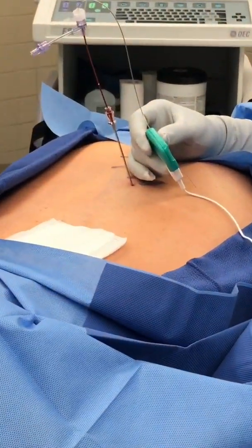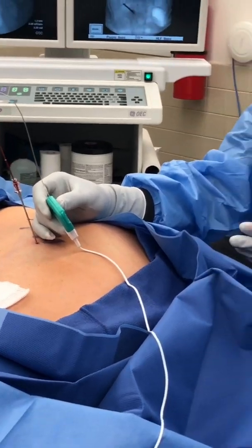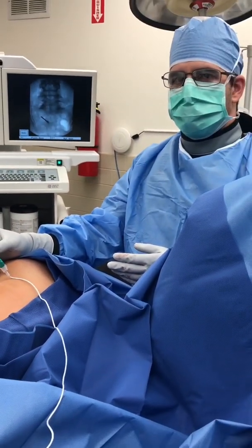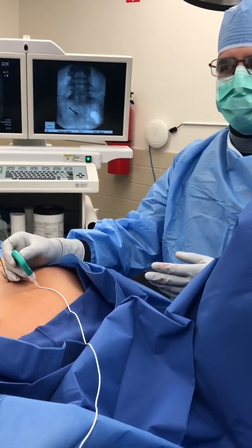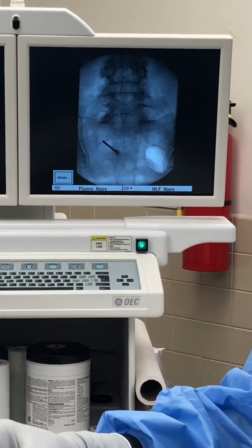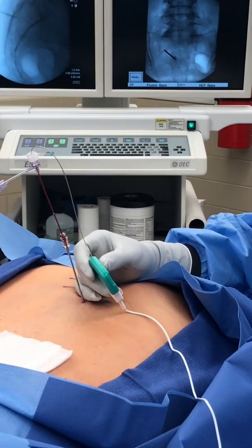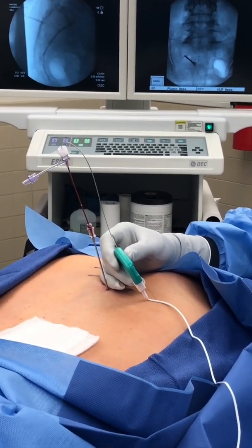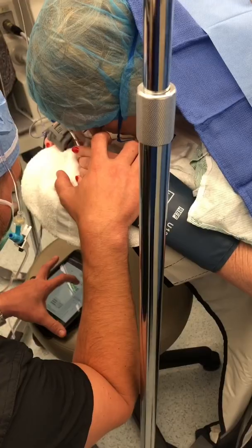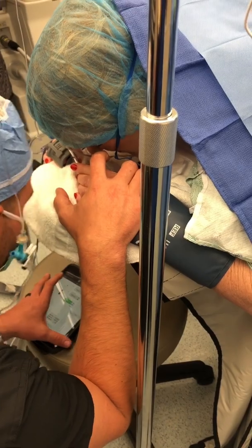Any tingling there? How about now, any stimulation? How are you feeling that? Patient: My left foot. Is that in your foot? Just in my left side. Feel that in your left foot, underneath on the bottom there? Patient: Yeah. Perfect.